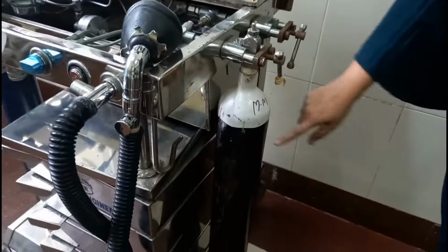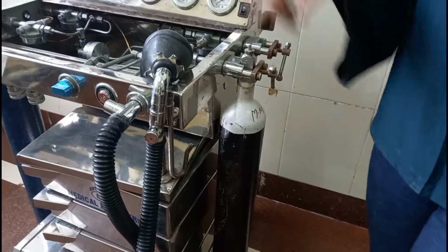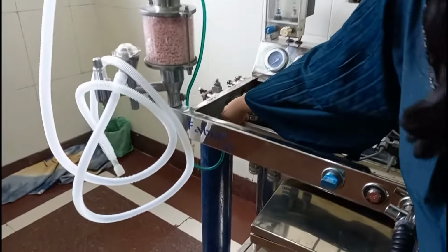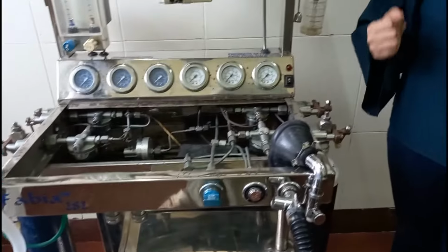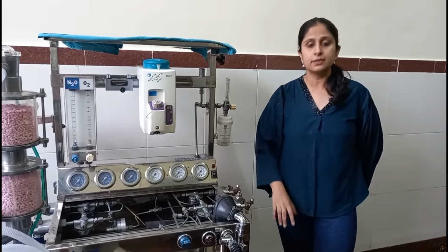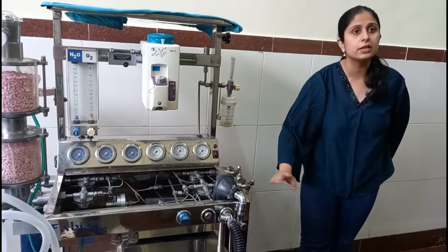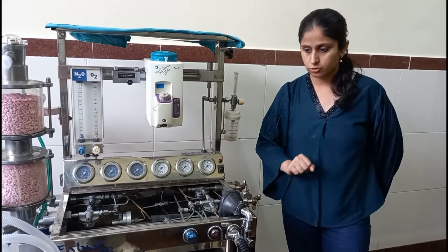As we can see, this oxygen cylinder has a black body and white shoulders, and the nitrous oxide cylinder is a blue body cylinder. The carbon dioxide cylinders are grey in color. The helium cylinders are brown in color, and the air cylinders are opposite to this. They are white body and black shoulders. So this is all the color coding of the cylinders so that we do not attach the wrong cylinder.